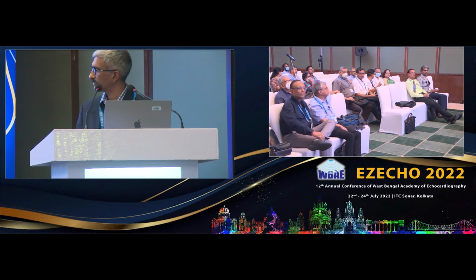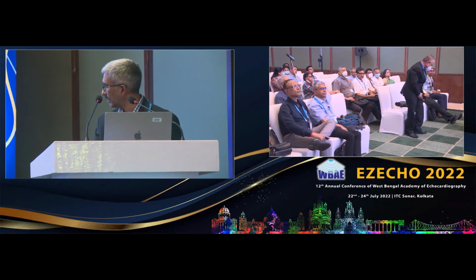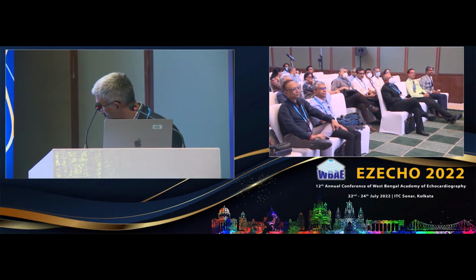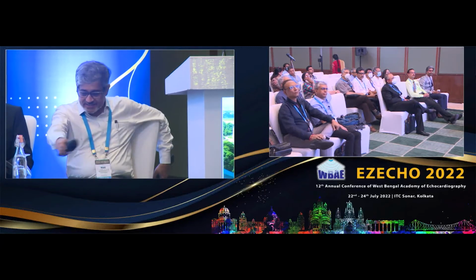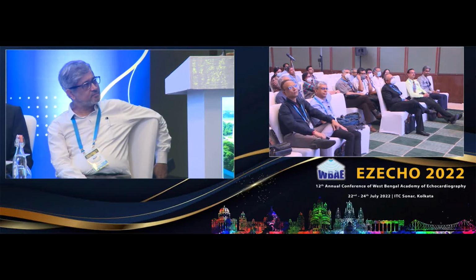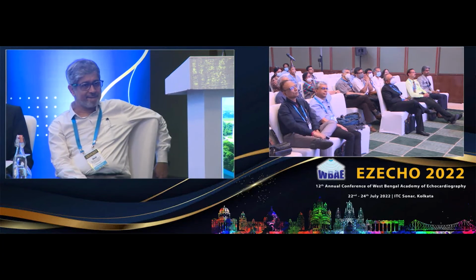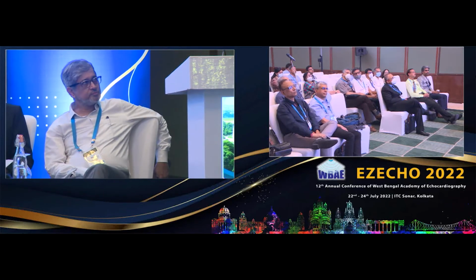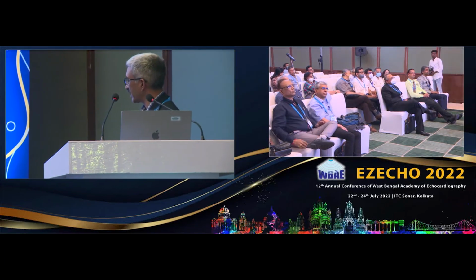Dr. Sanjay, what is the status on patient with left bundle branch block and a pacemaker, where we actually get a problem with the PET scan, not the PET scan, the nuclear scan? Right. So in terms of just looking for ischemia and viability, to look for any changes in perfusion, it's very easy. You can see ischemia and viability regardless of the bundle branch block, as long as there's no significant intermittent arrhythmias within that particular patient. And with the left bundle branch block, we typically see the abnormal dysynchronous contractility as well.